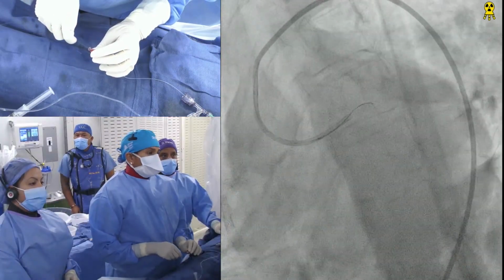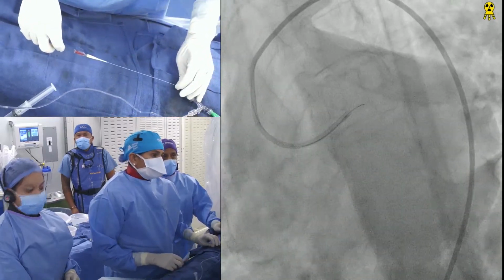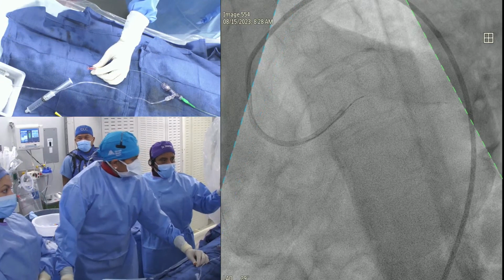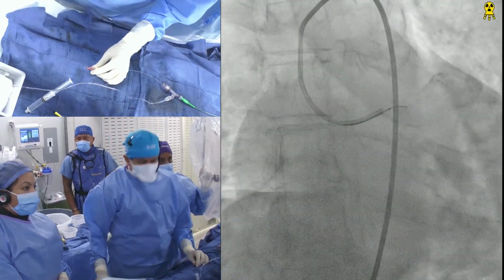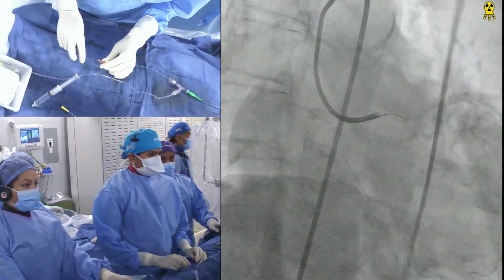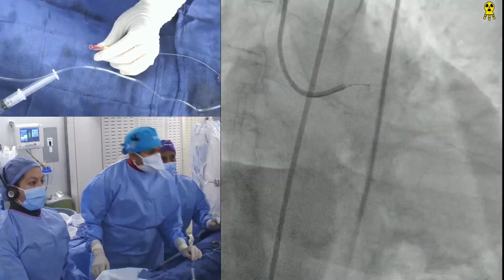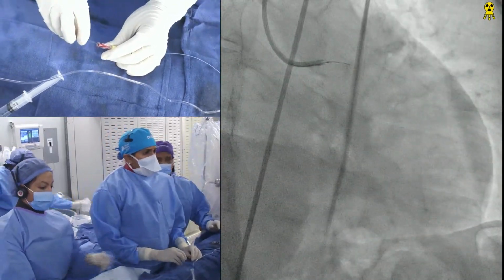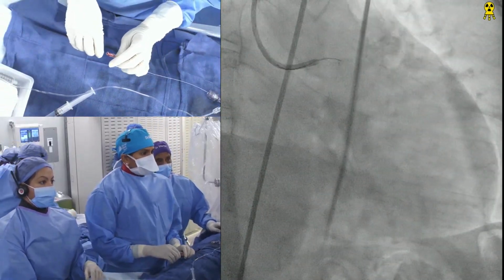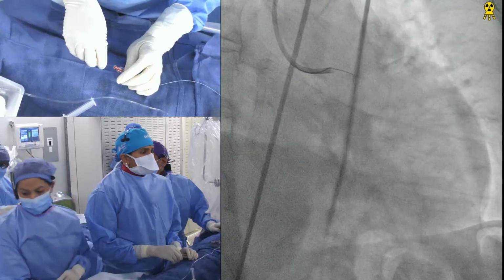This is the kind of case where you need a little angulation. Some people say we can use a twin pass going into the ramus with a side branch going to the circumflex. That is another view, but we never had good success with that. So this is the kind of case where an angulated catheter, whether Supercross or Venture, can be used. Would an Amplatz guide help? No, not the guide. We have so many adjunct issues nowadays that Supercross will be less traumatic. An Amplatz guide may increase your success a little bit, but it definitely has more trouble, meaning chances of dissections. Ready with the Supercross and exchange length?